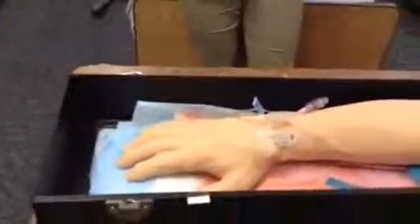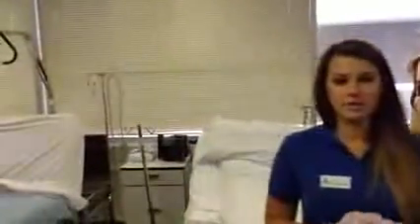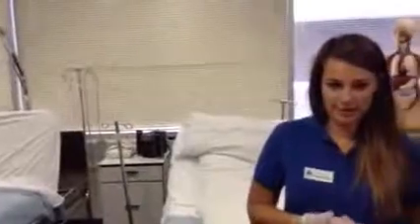Of course, I'm going to monitor the IV site for edema, pain, tenderness, redness, and any allergic reactions while administering the antibiotic. And then afterwards, I would make sure that I document on the MAR. I would record the time, date, and I would make sure that I state the condition of the IV site, and I would record the amount of fluid given to the patient.